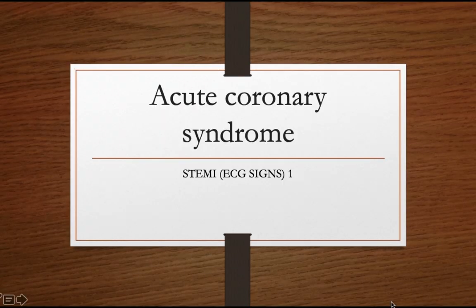Hello and welcome to today's presentation on ECG signs of ST elevation myocardial infarction. If you recall, in our previous tutorials, we said that in STEMI there is a complete occlusion of the coronary artery. And so, acquiring an ECG within the first 10 minutes when the patient presents at the emergency room should be the first step in recognition as well as treatment of STEMI.